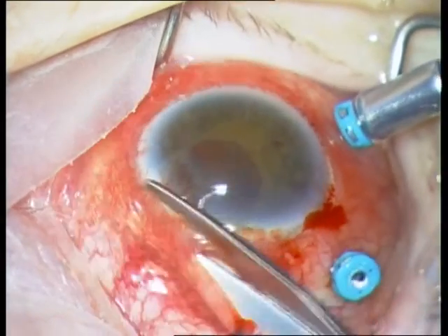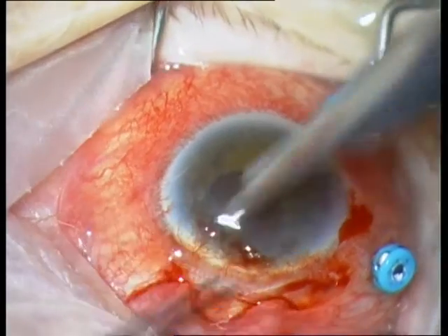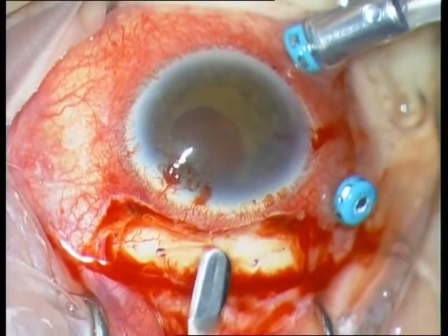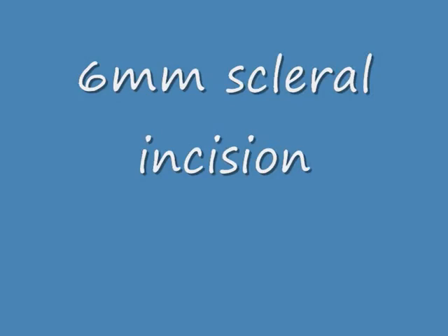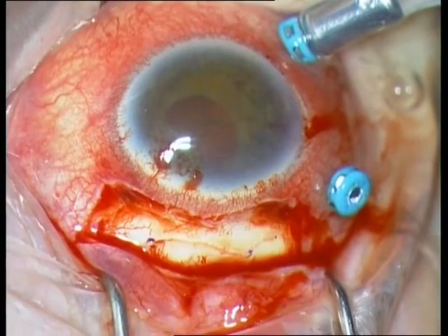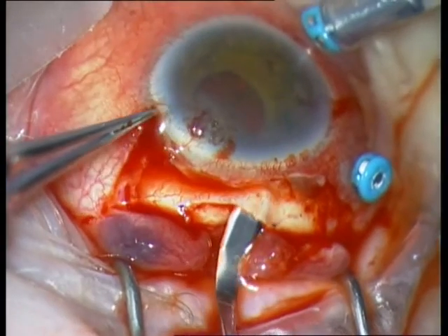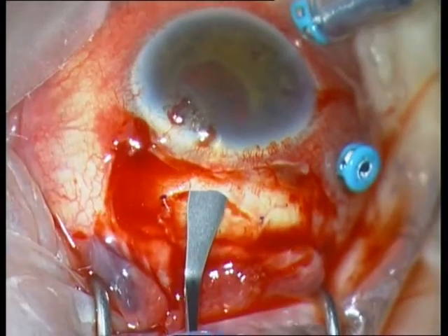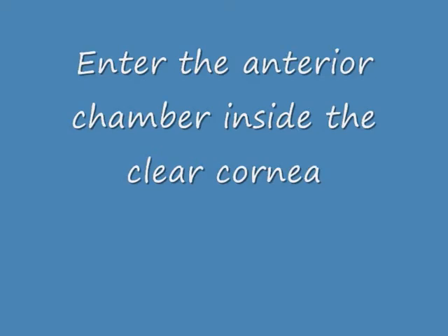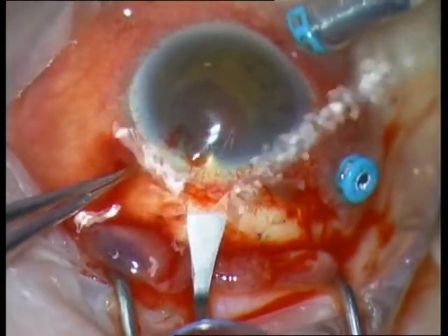The next step is a limbal peritomy at 12 o'clock to prepare a frown incision. I marked 6 mm and I'm continuing now with a bevel-up knife. A scleral frown incision from 12 o'clock — enter first the anterior chamber if the knife is in the clear cornea.